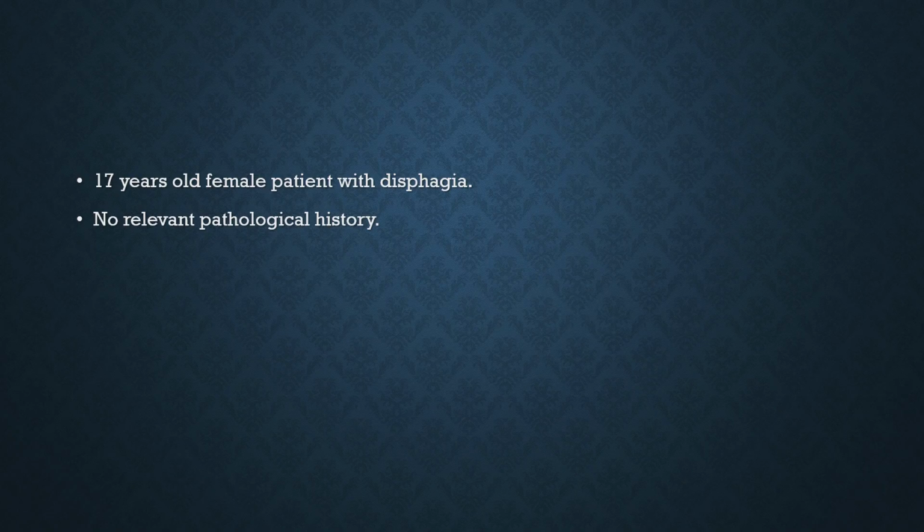Good morning, my name is Edgar Hernandez, and today my case review is about a 17-year-old female patient with history of dysphagia. No relevant pathological history about the patient. However, a few days before coming to our hospital, she had an upper gastrointestinal series reporting an external compression of the stomach. So her physician asked her to perform a CT of her abdomen.